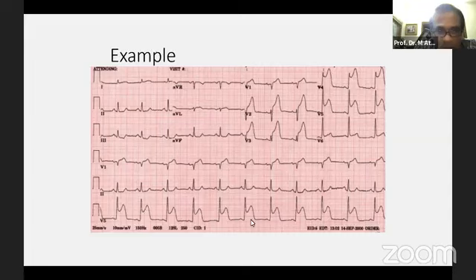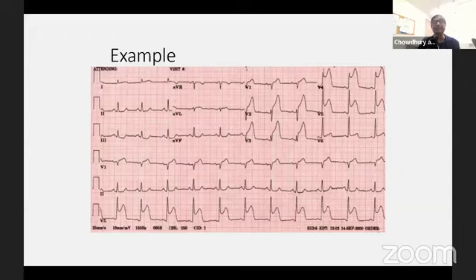Hafiz bhai, so looks like lead 1 to lead 6, and this is like extensive anterior, correct? We don't see it in lead 1 and aVL. So I don't know, Wadud, okay to say that this is extensive anterior? Most likely a proximal LAD.